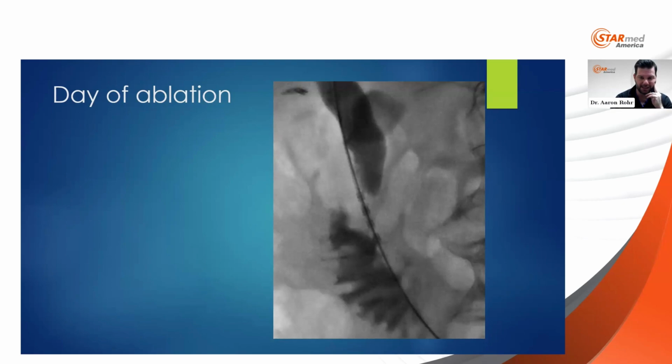So this is the 18, which earlier on in my experiences, I was hesitant to use just out of, quite frankly, lack of experience with the devices beforehand. So I was kind of spot welding my way through. So with the 11, I knew how to use it. I was very comfortable with it. So I would hit it in a few sequential spots. With the 18, it just saves that time and that kind of variability that you'll have of the burn across the stenosis. So this is the actual 18 over the exact same system.